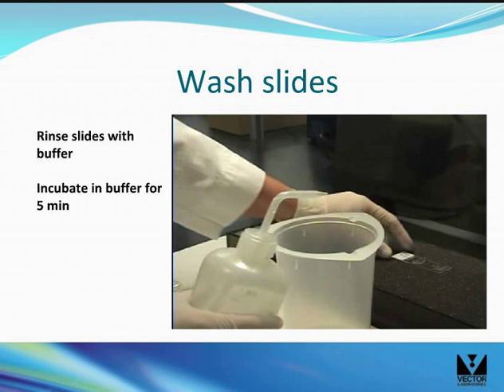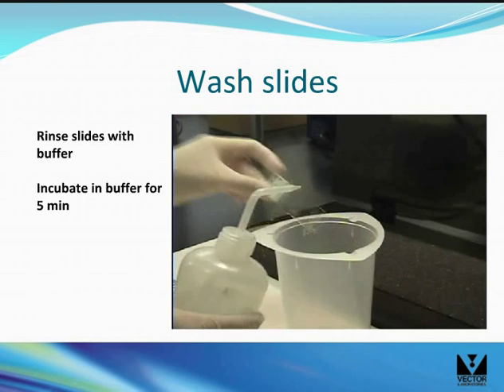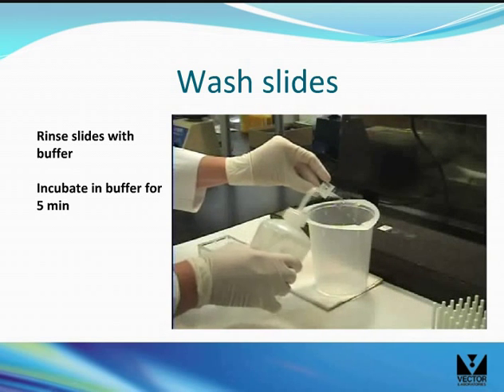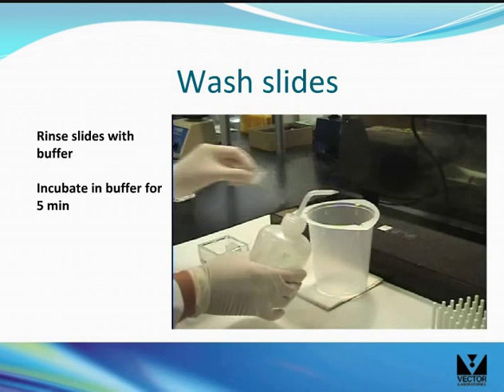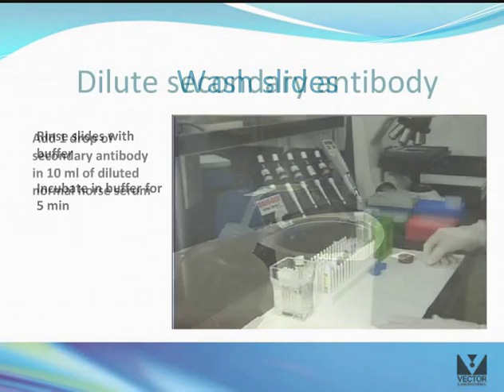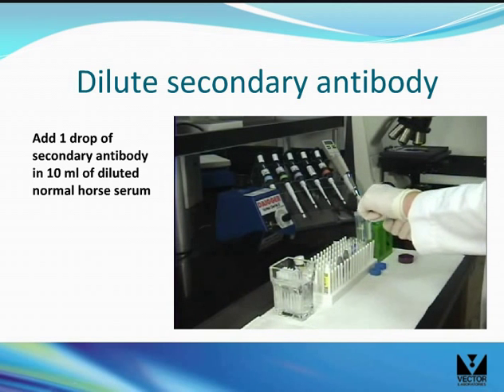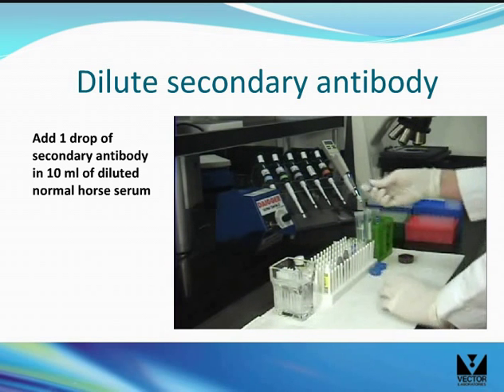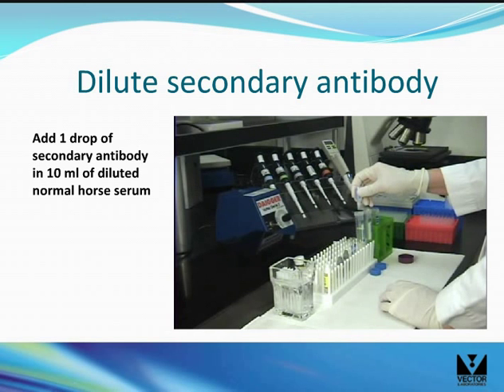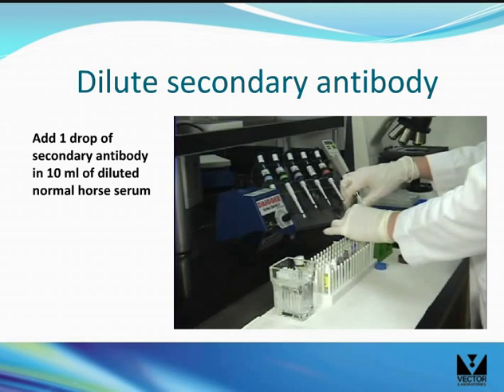Rinse the slides by passing a stream of buffer from a wash bottle gently over the section as shown. Place the slides in a Coplin jar and incubate in buffer for 5 minutes. Add one drop of the secondary antibody stock into 10 mLs of diluted normal horse serum. A polypropylene bottle or the empty dropper bottle can be used.